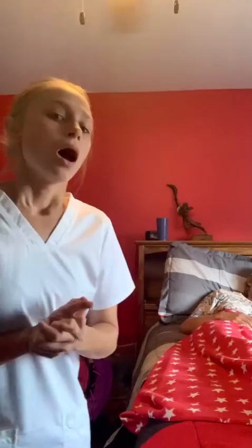Then I'm going to identify my patient using 2 identifiers. Then I'm just going to provide for privacy, close any curtains, close the windows, anything like that. And then I am also going to find out what side is my patient's good side. So in the care plan, it states that my patient's good side, strong side, is his right side. So I will be transferring my patient on his right side today.